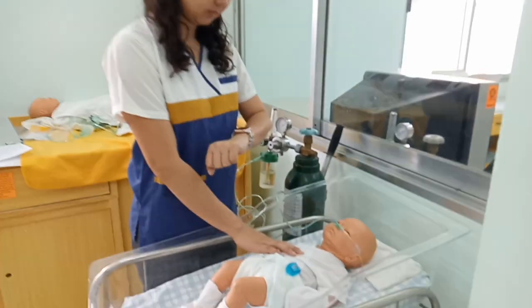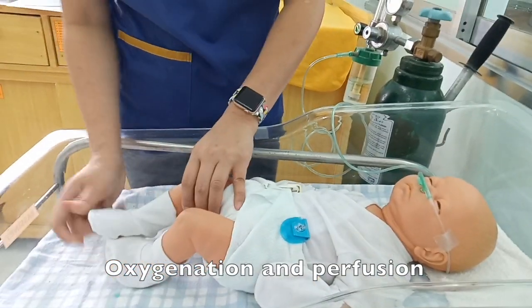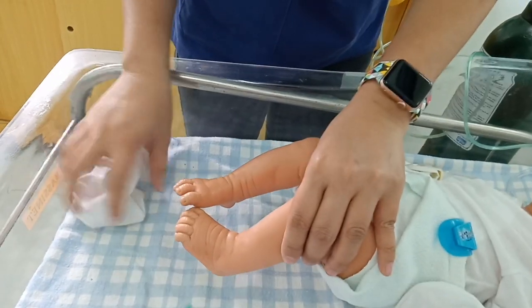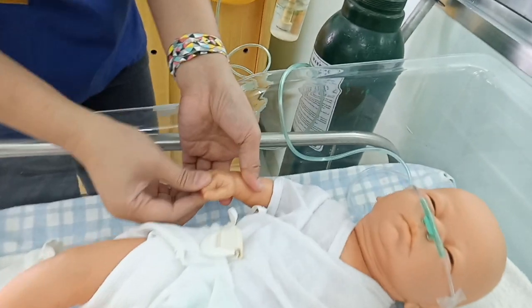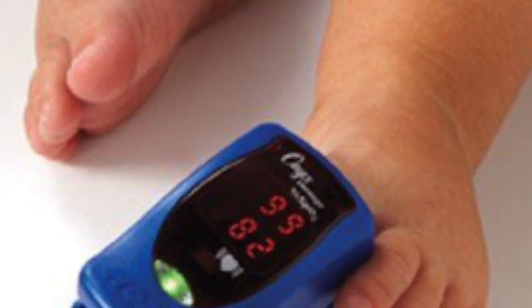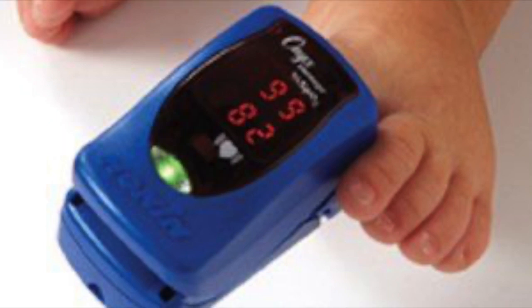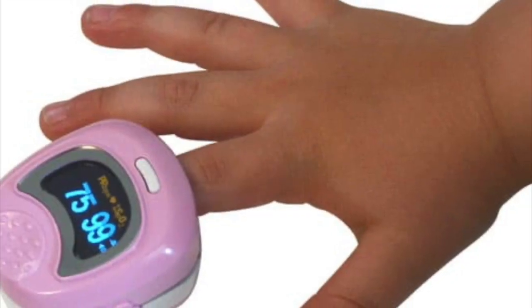Evaluate the following criteria. We have oxygenation and perfusion. We can check it by getting the RR and checking the capillary refill, or check if the patient is cyanotic. Or you can use pulse oximeter to check for the oxygen saturation. Continual monitoring with pulse oximeter is required for patients on oxygen therapy.